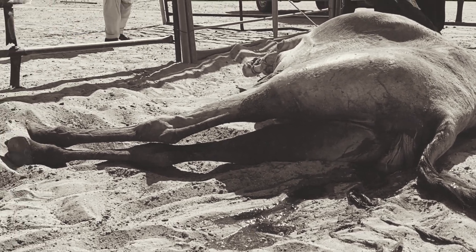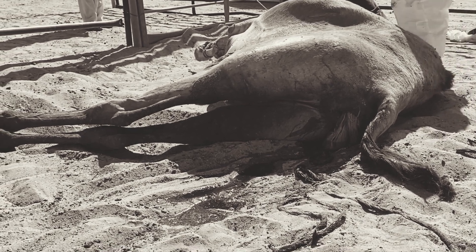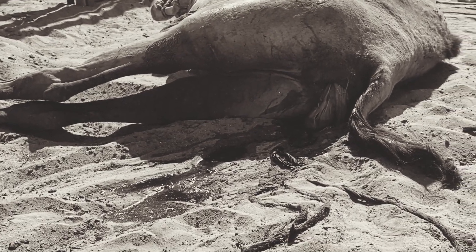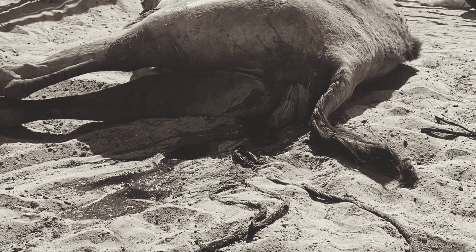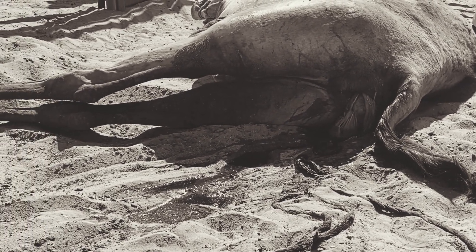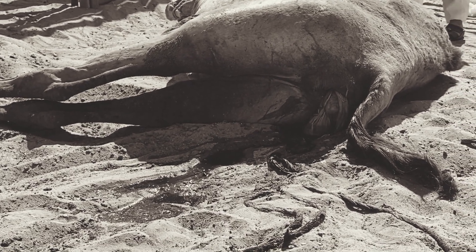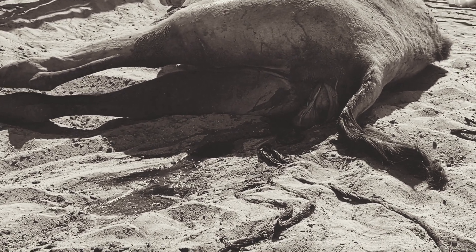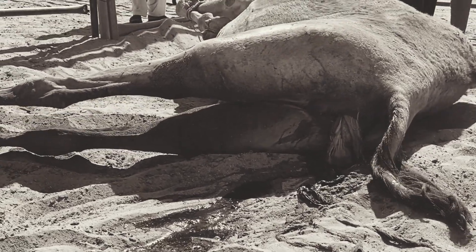We pulled it slowly just to make sure we would not rupture the uterus and the cervix of the mother. Right now we're done. We're going to give her antibiotics and anti-inflammatory. That placenta you see right there — we'll just leave it, and it will hopefully come out after a few minutes. The reason we're not going to force the placenta is to avoid rupture and to avoid the uterus from coming out, because right now it's still very vulnerable.